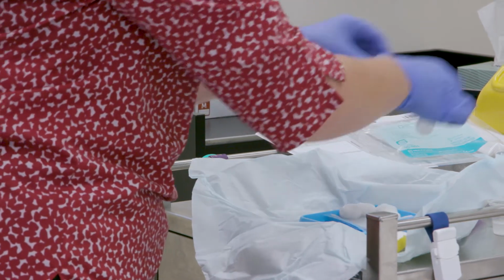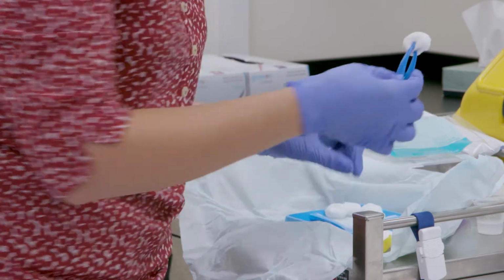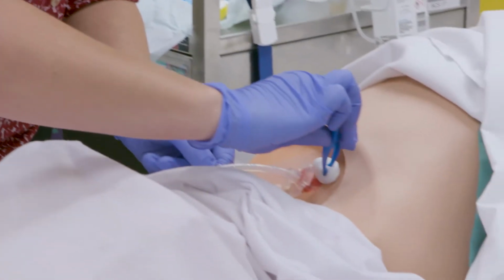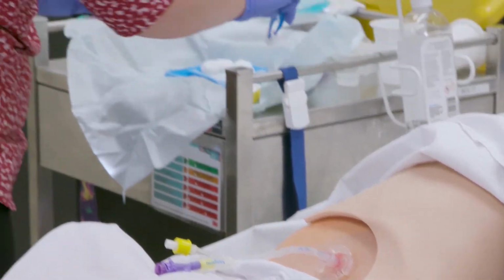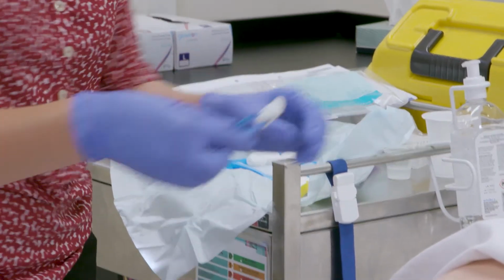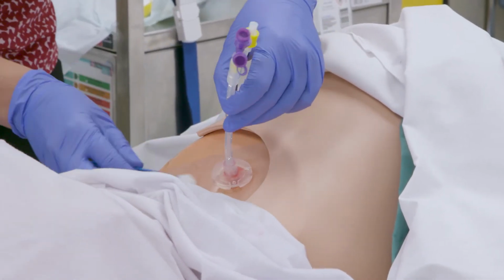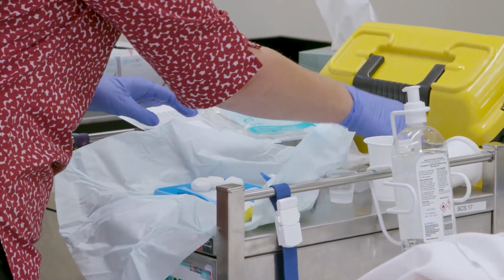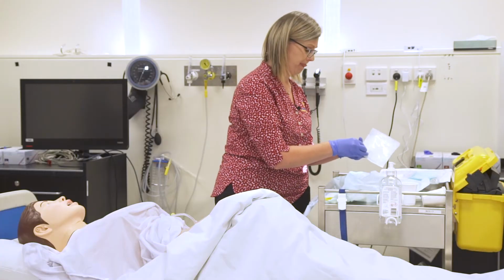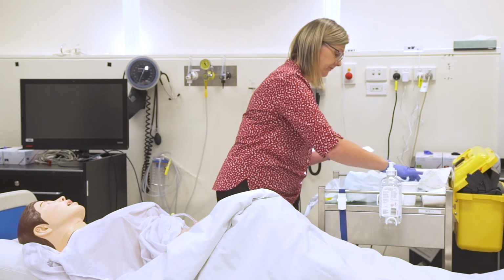Clean. We want to go around the area to clean up any debris, food, inspect the site. Because there was some red around, we might put a trouser dressing on that wound. That stoma site, sorry.